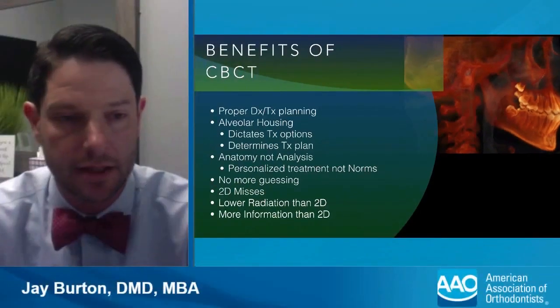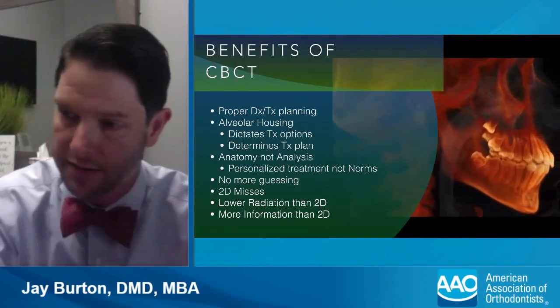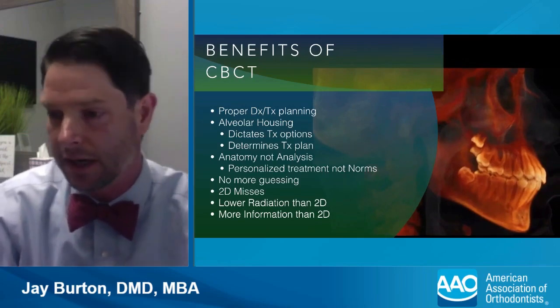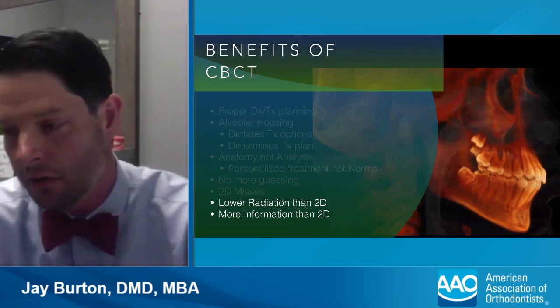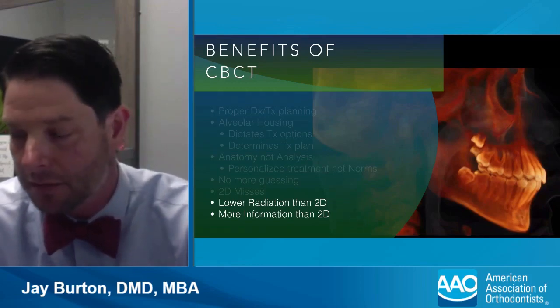And at the end of the day, let's say you take away all of the ones at the top, the proper diagnostic and treatment planning, alveolar housing, anatomy not analysis, and you're just left with lower radiation than 2D and more information than 2D.